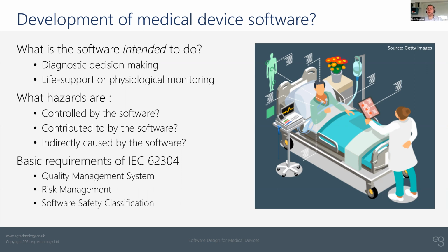You have a good general description of what your product does, but when you actually try to codify it into a few sentences, a couple of paragraphs, that can become more difficult, and it has really big implications for your product development, your medical device development as a whole, because the words that you put into that statement can govern everything from whether it's a medical device, whether it's health software, whether it's an in vitro diagnostic, through to the clinical claims you're making, whether it can diagnose, whether it provides decision support, whether it's life supporting or physiological monitoring.